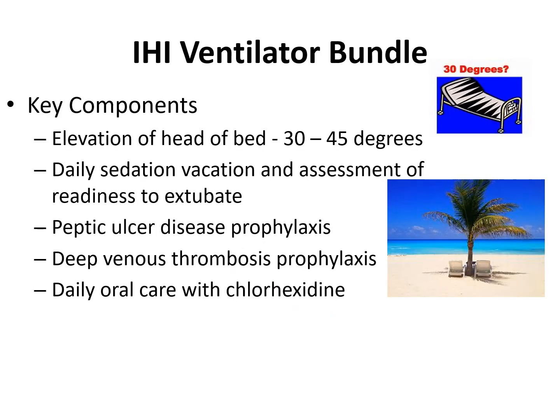So let's do a little review of the ventilator bundle. The first thing is your head of bed. Again, 30 degrees or more, so no less than 30 degrees, between 30 to 45. Use the tool for the actual degree measurements, such as the little ball that's on the side of the bed, and that'll show you the actual head of the bed in degrees. This will help decrease risk of aspiration of gastrointestinal contents and oral and nasal secretions.